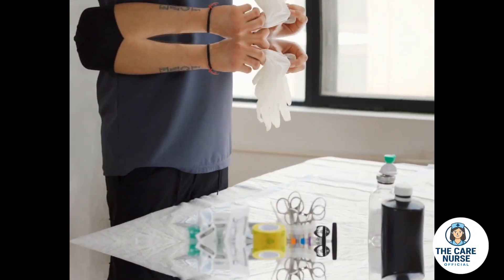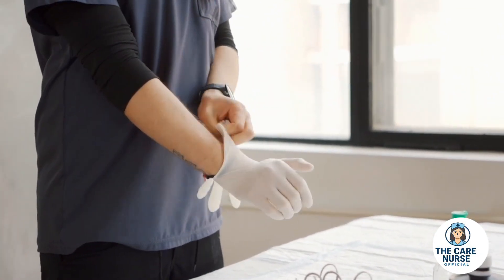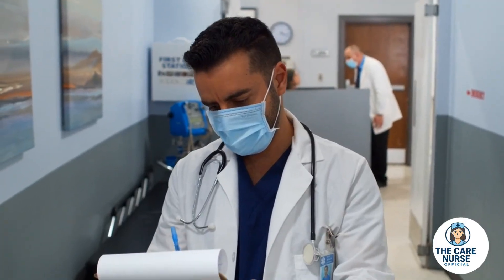Welcome to the Care Nurse Official. Today, we are presenting a demonstration of an intramuscular injection for educational purposes only. This video is designed to highlight the professional process and must not be performed without proper training.